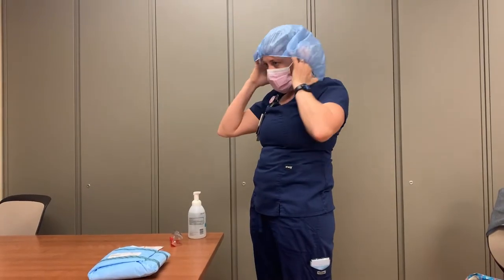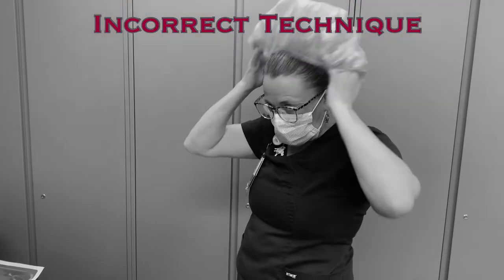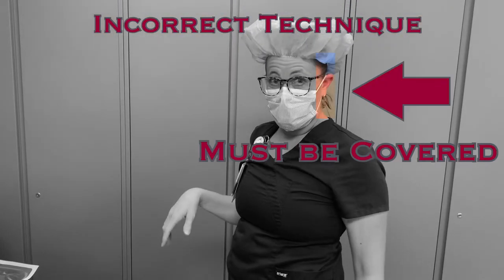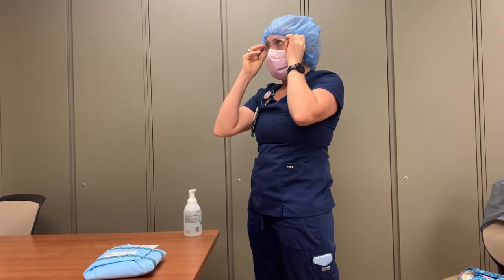Don the bouffant cap. This must contain all of your hair — it will cover your ears and stretch down the back of your neck to contain and cover your hair. Don your eye protection if it is not attached to your surgical mask.